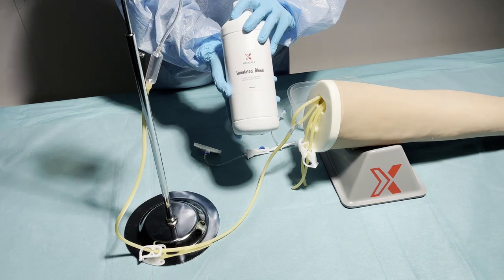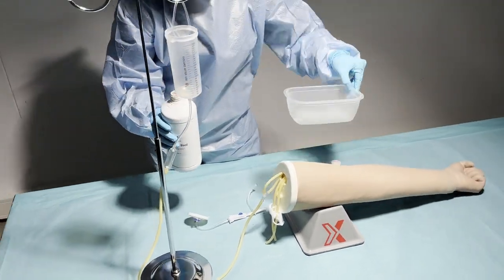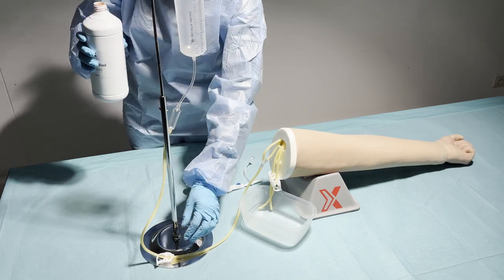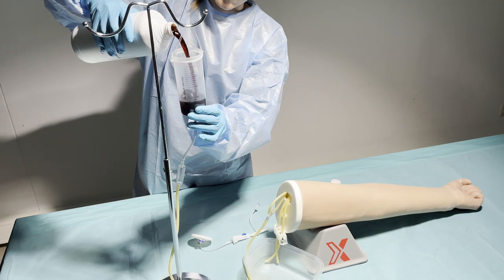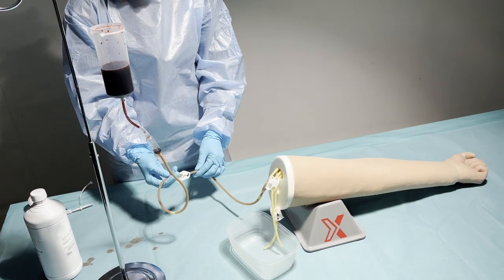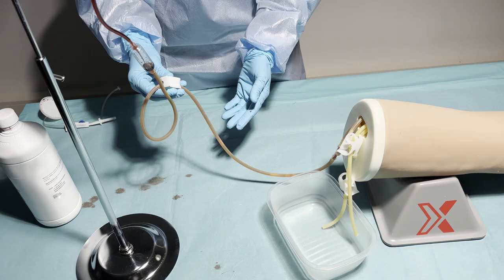Do not close the veins completely yet, because air needs to come out. You can also use a container to collect blood that is flowing out of the veins. And now that the IV bottle is filled with blood, we can release the clip to let the blood flow into the IV arm.